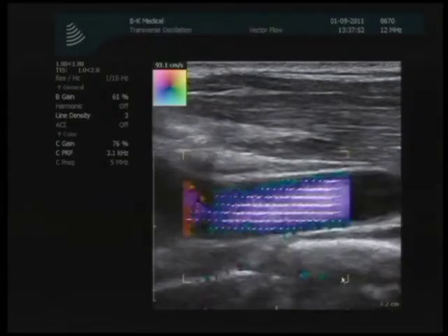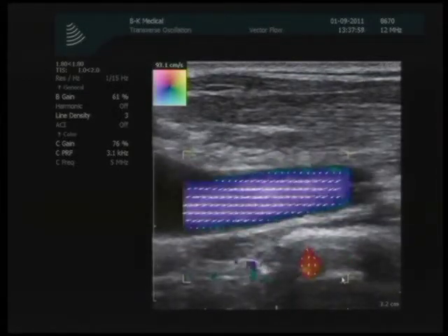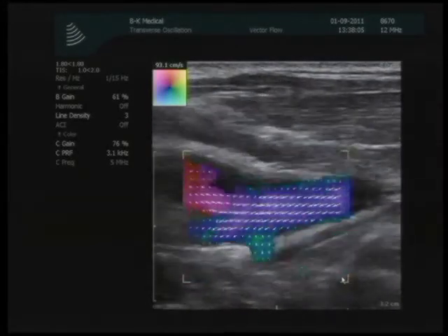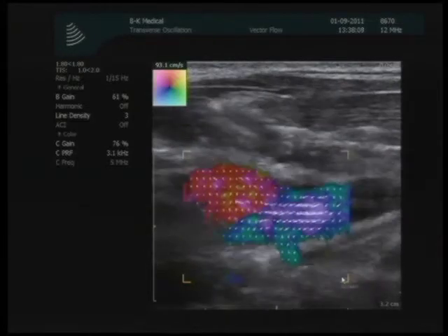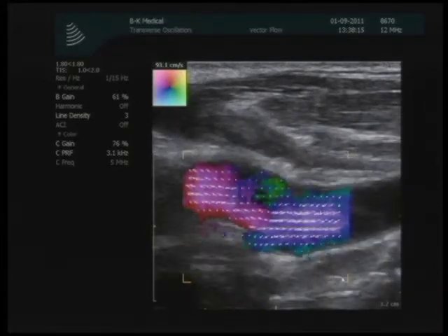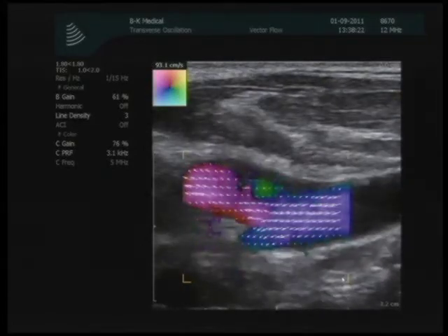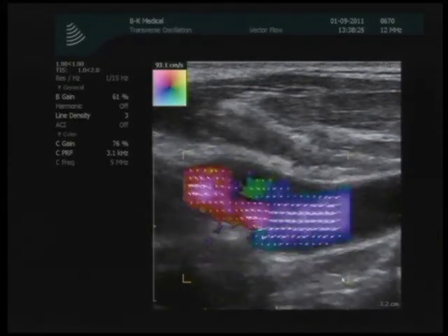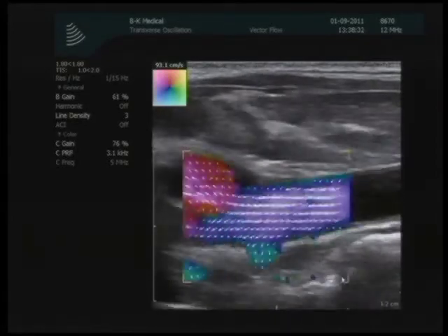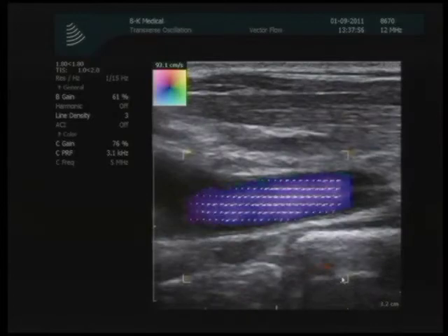And if we take the example here, we're in the carotid artery, and you can see now it's fairly laminar. And now we're going upstream, so we're going up to the bifurcation. And what you can see in the top branch is that a mixing of other colors comes in, and that's because of this vortex. So we have that at certain parts in the cardiac cycle, we can see green and red, so it's tumbling around. And this is what we see in normal patients. So this is what happens for any kind of human being. And the interesting thing is that you see it in the carotid artery, and other arteries you don't.